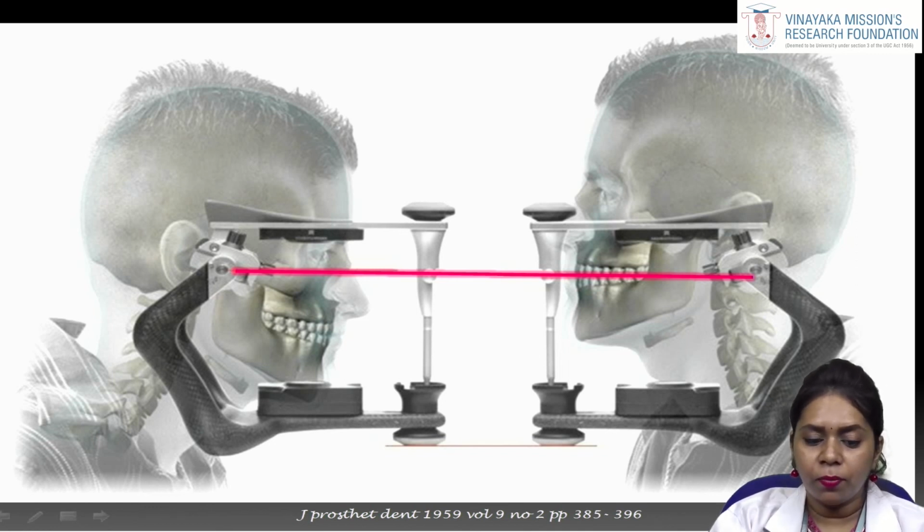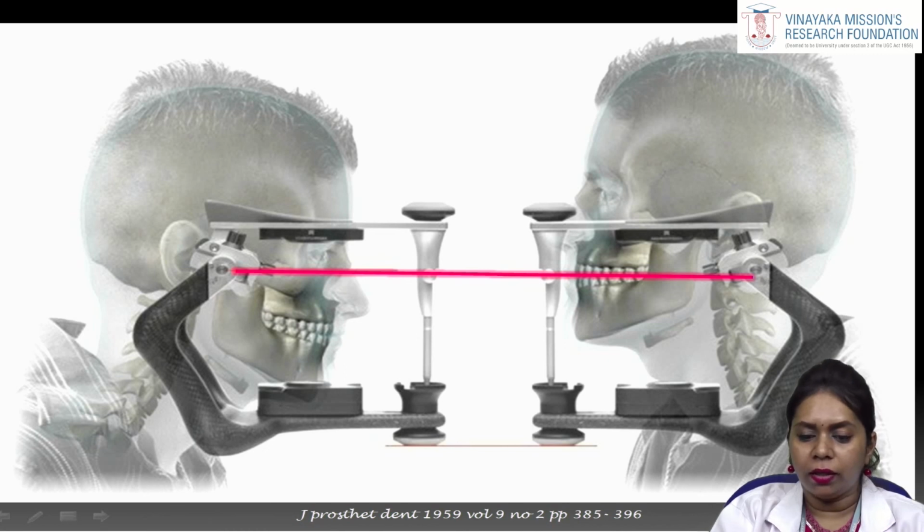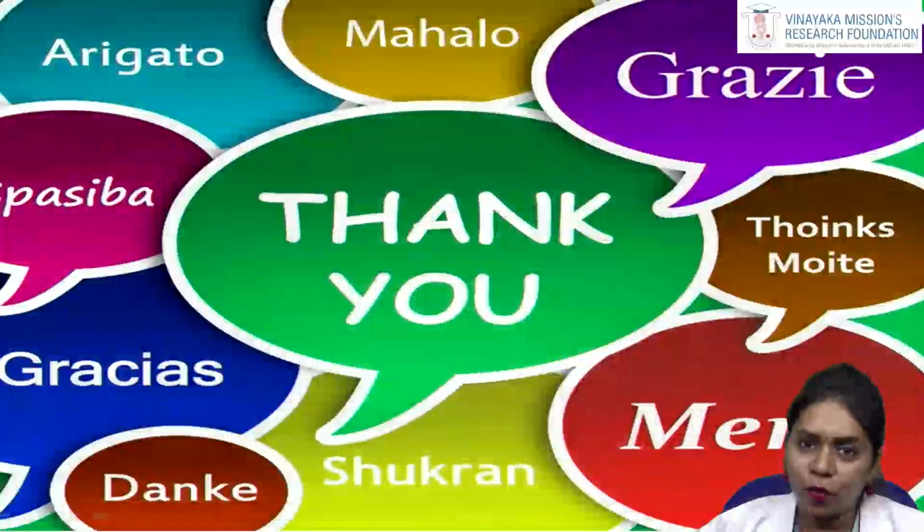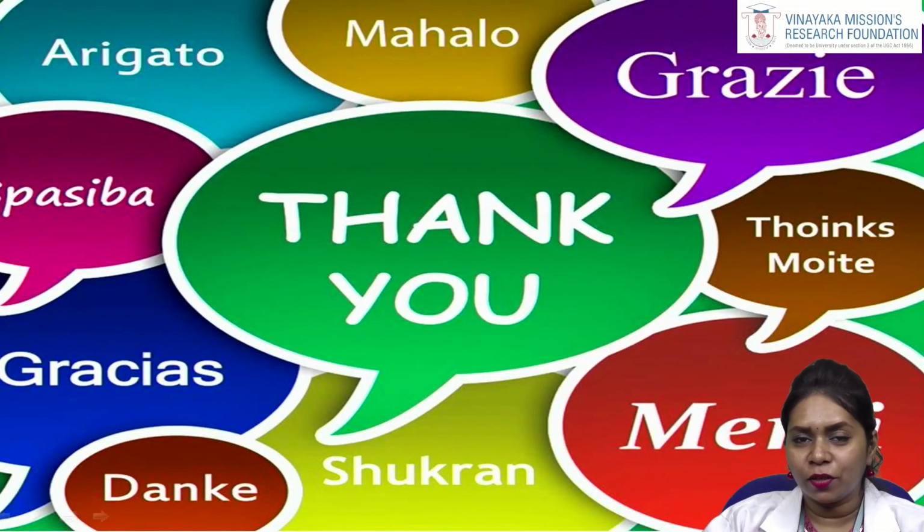But since the procedure is not complicated or time consuming when using an arbitrary FACEBOW, the chances of minimizing error must be reduced. By mounting the maxillary cast to the same relationship that is in the patient will result in an opening and closing movement recorded on the mid-sagittal plane that can be duplicated in an articulator using a FACEBOW, hence it must be used.